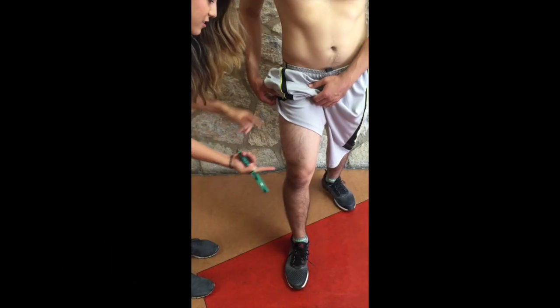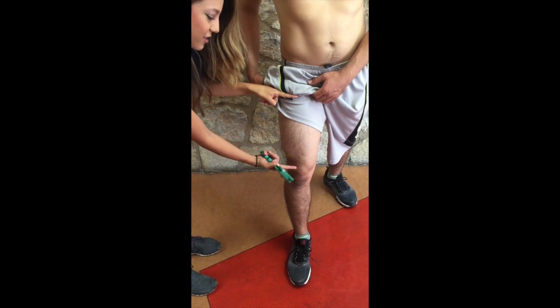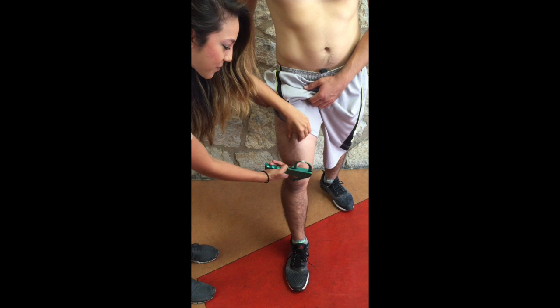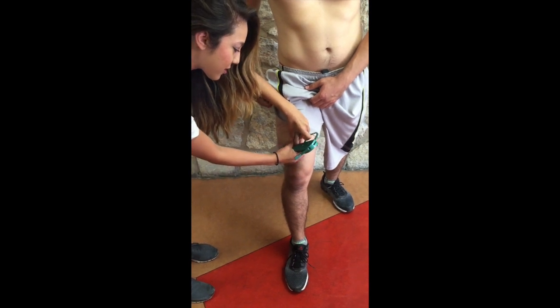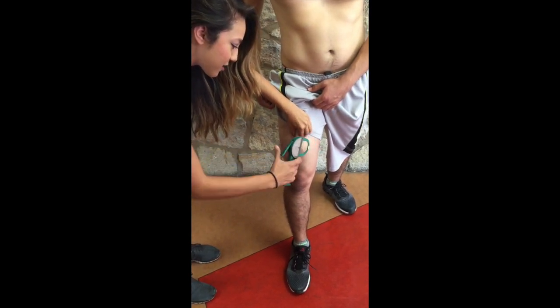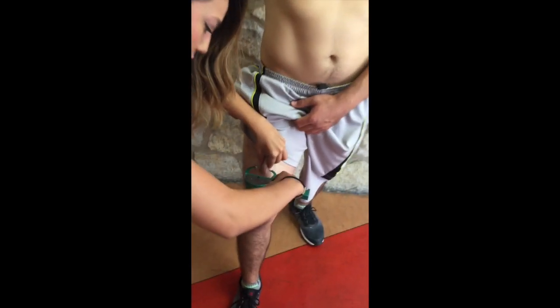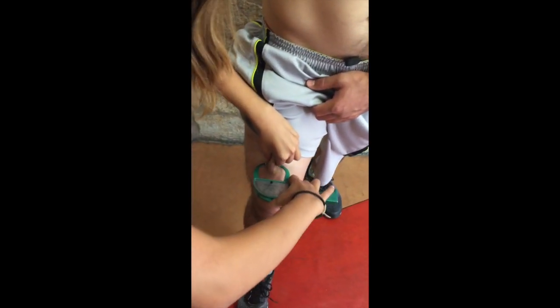Prior to measuring the thigh, have the subject put all the pressure on their left leg, leaving the right leg relaxed. The thigh is measured using a vertical fold on the anterior midline of the thigh, midway between the proximal border of the patella and the inguinal crease of the hip.